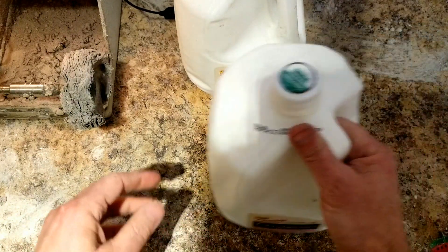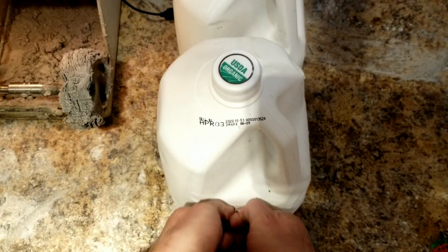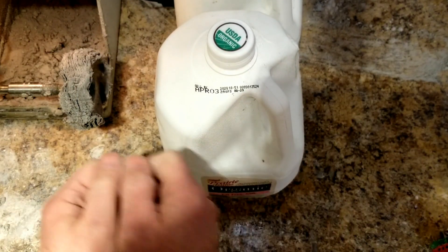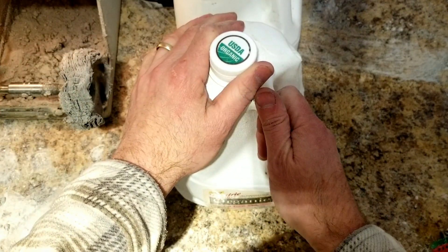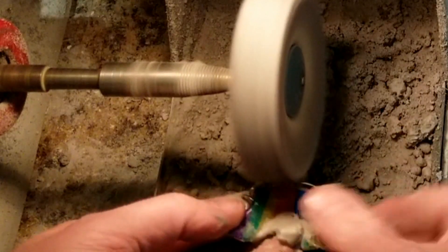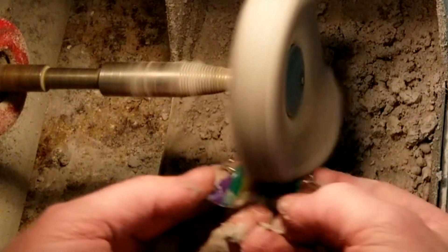So your homework: grab two empty gallons, fill them up with water, put them back to back, and get that feeling of what it feels like to push. That is the pressure. I've taught so many people, and like I said, they're either pushing too hard, too soft, taking forever. I am pushing on this retainer the same way I was pushing on these milk gallons — two full gallons is the exact amount that I'm pushing on it.